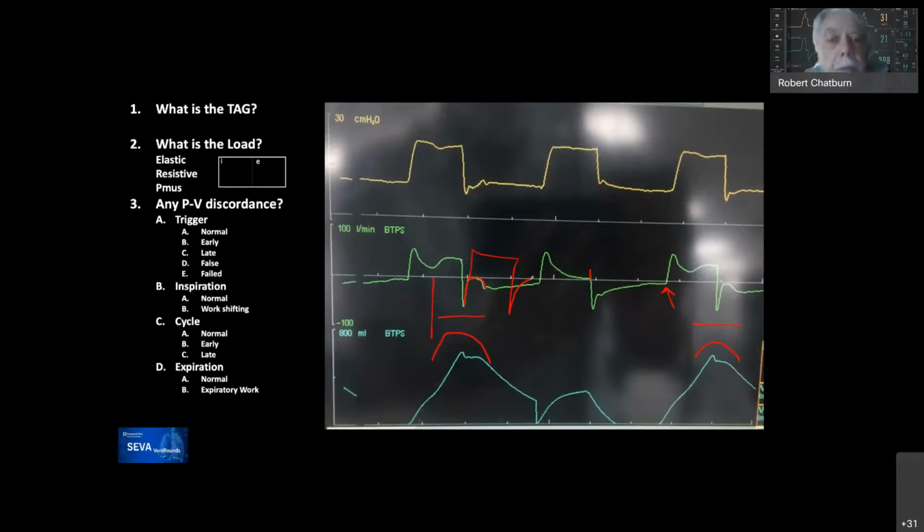Yeah, right. Because since we're in pressure control, that definitely makes sense. In volume, I'm sure that tidal volume is too big. It's probably around 600, right? Yeah. So if you could do something to get rid of it, it would probably be safer for the patient.